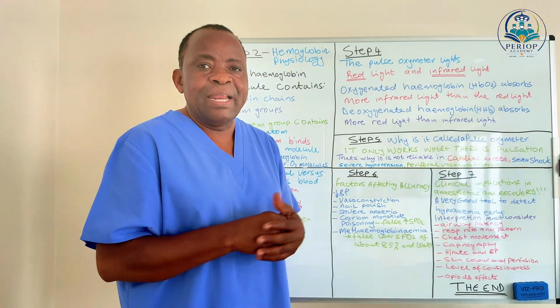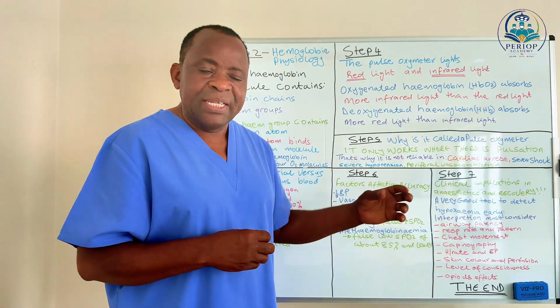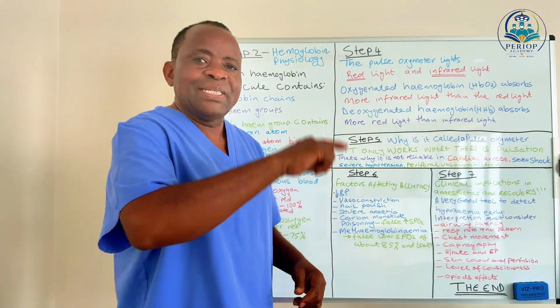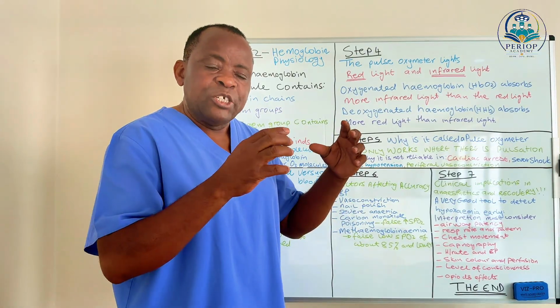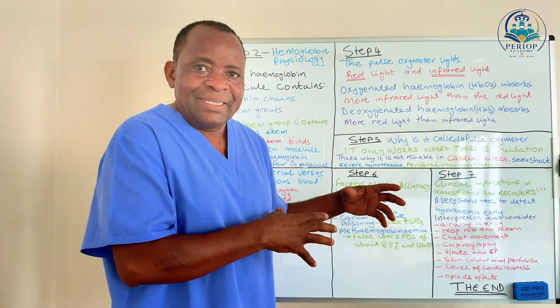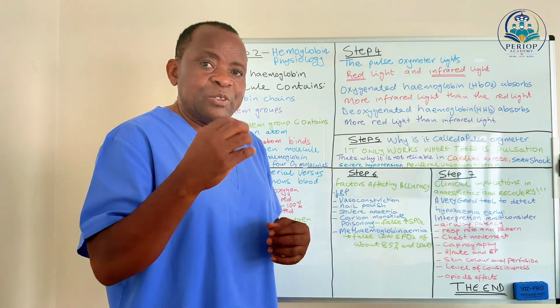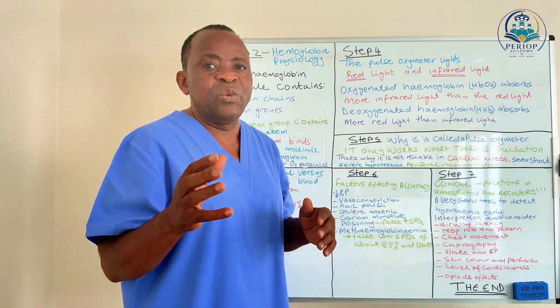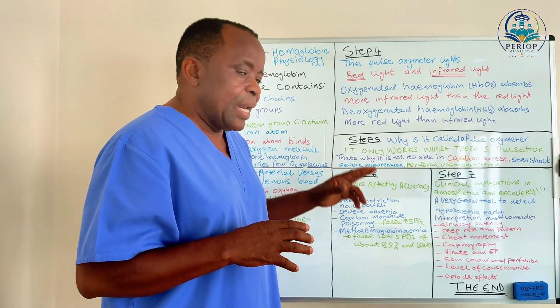And when they have an LMA, you've got a very good, accurate measurement of how the patient is breathing through the oscillation of that white line you see, and it shows you how patent the airway is. And those same values will be translated on the screen for you to evaluate the oxygenation of this particular patient.